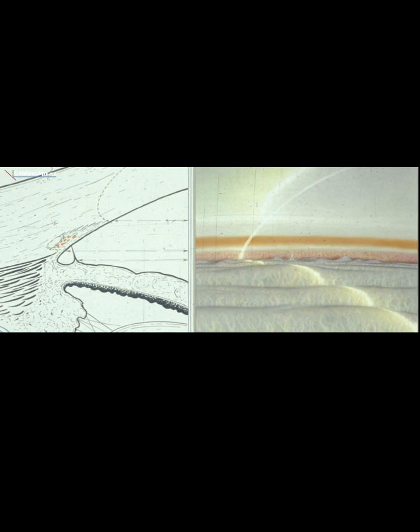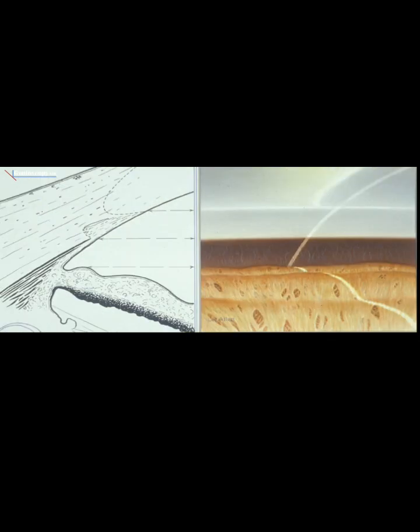This is an angle that's also inserting into the ciliary body face. Here's scleral spur, ciliary body face here, 2+ pigment, maybe even 3+ pigment, flat iris, so D45F2. Really, really deep angle, either high myopia or angle recession. So this would be an E. The iris is flat, it's at least 45 degrees. We rarely write a number higher than 45 because honestly the difference between 45 and 55 in terms of risk of angle closure is 0. So E, 45 or 50, F for flat, 0 pigment.